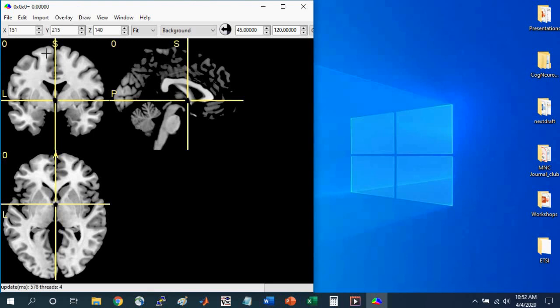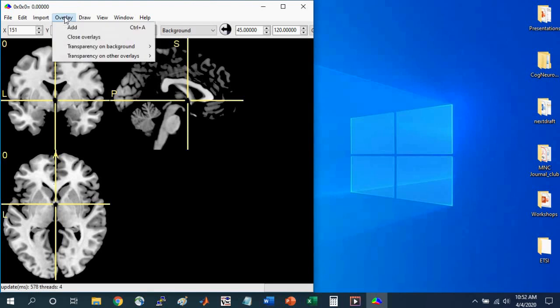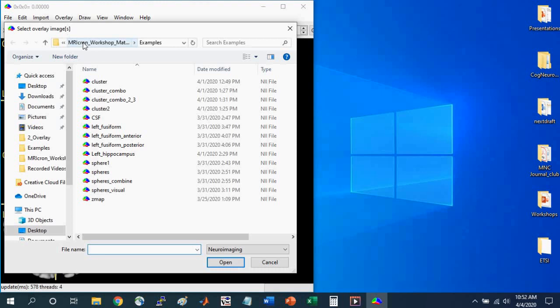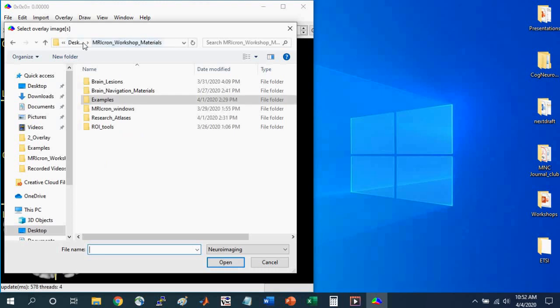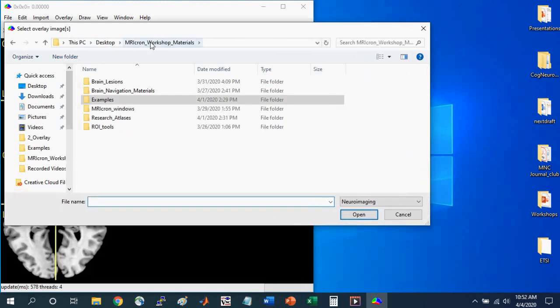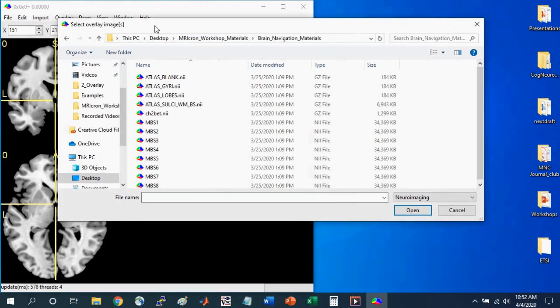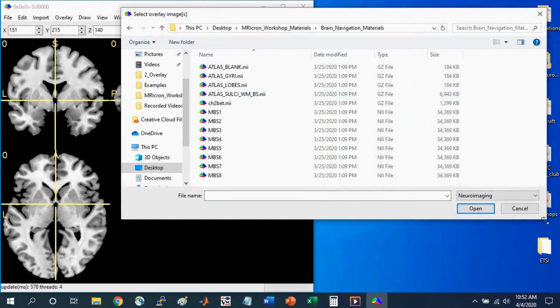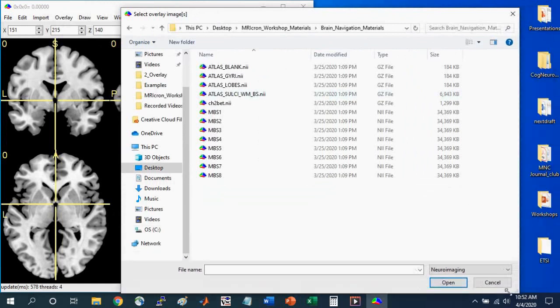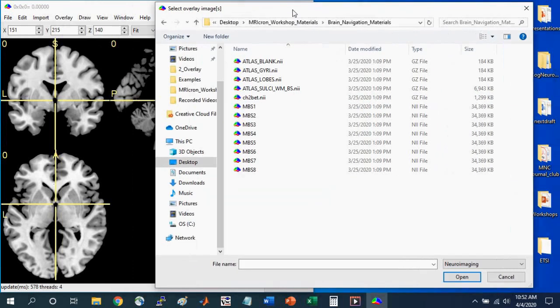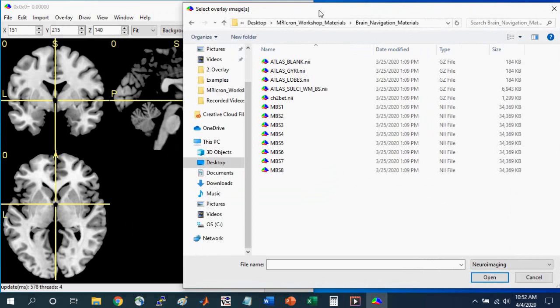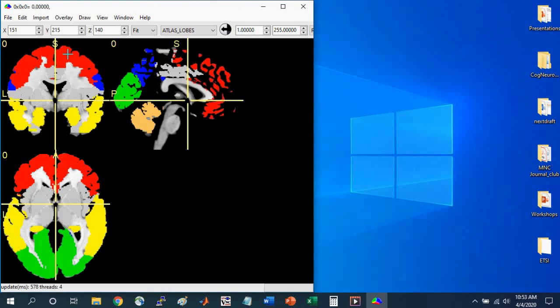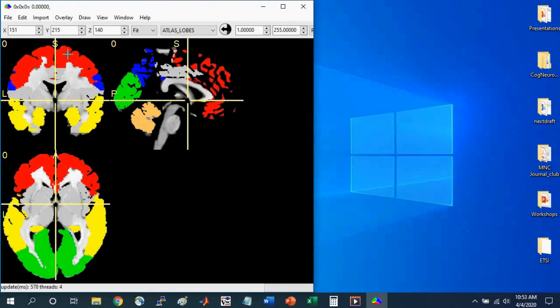The first thing I'm going to do is open up an overlay and put it on top of this underlying brain that we see here. So I'm going to go to Overlay, Add, and I'm going to navigate within the MRI-Cron Workshop Materials folder into the Brain Navigation Materials folder. Within this folder, there's some materials that my colleagues and I developed for a cognitive neuroscience course. These can be used for any course for which you need to learn neuroanatomy. So open Atlas Lobes.